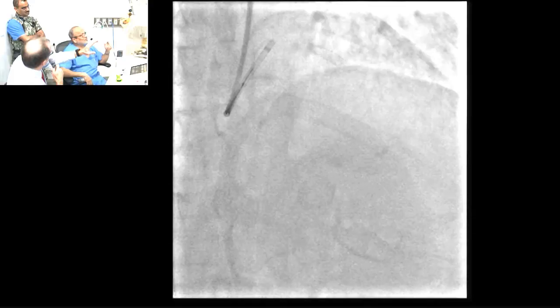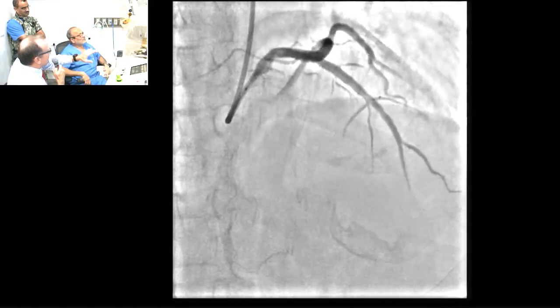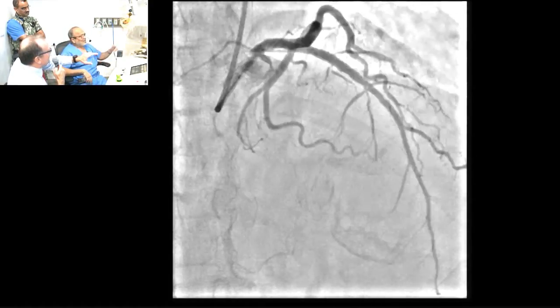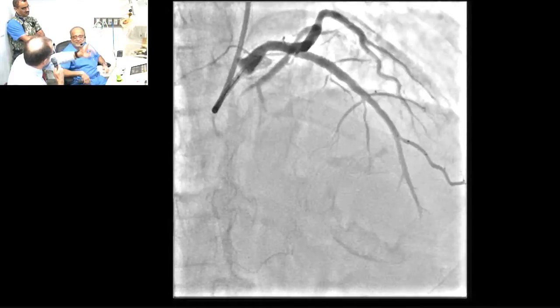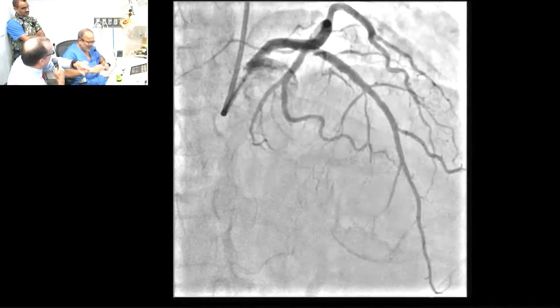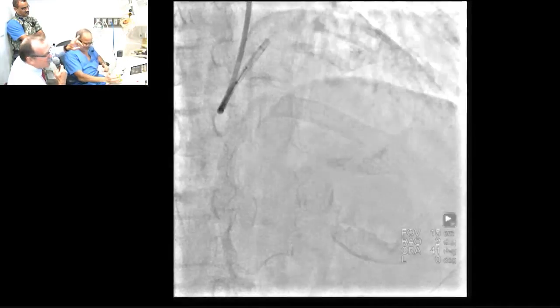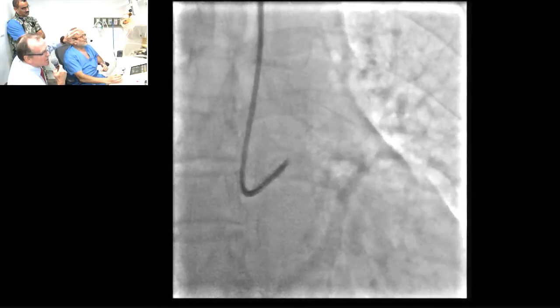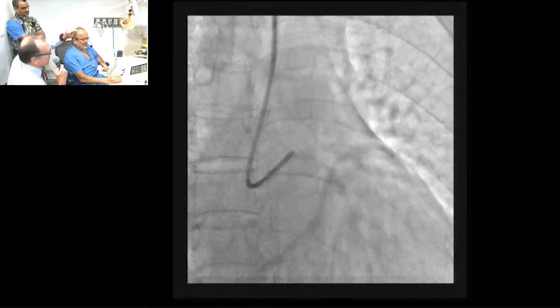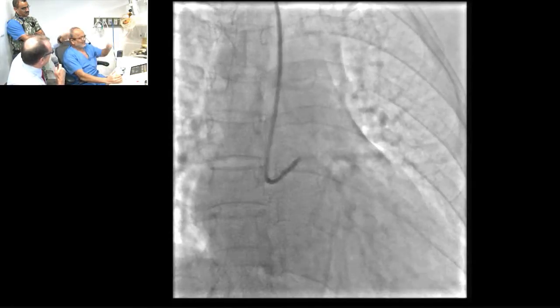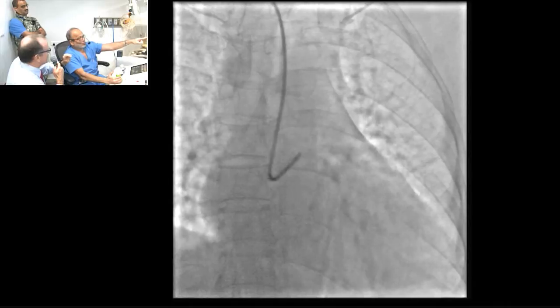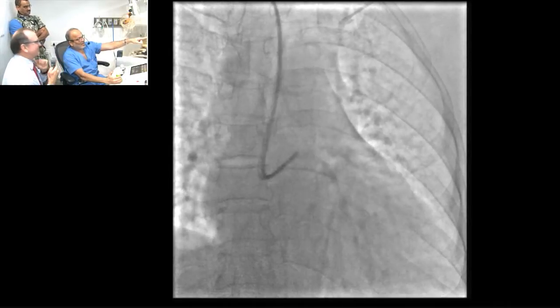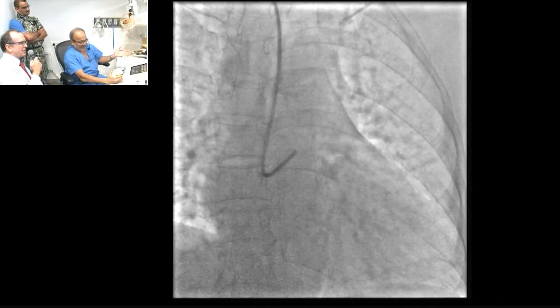It is a great-looking result and it looks as though we are finished. But we have Professor Akasara in the audience. I would like to hear whether he would routinely OCT this and then decide whether to post-dilate. First, let me show how I remove the guide catheter.